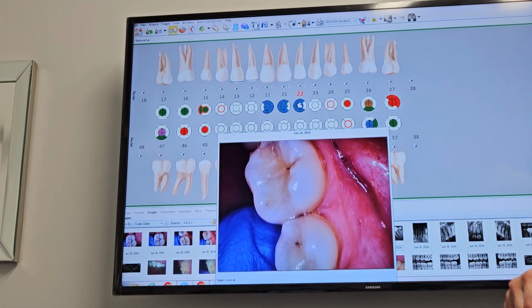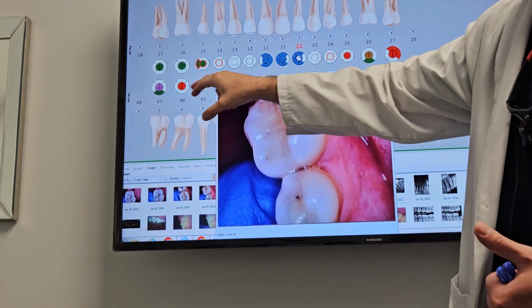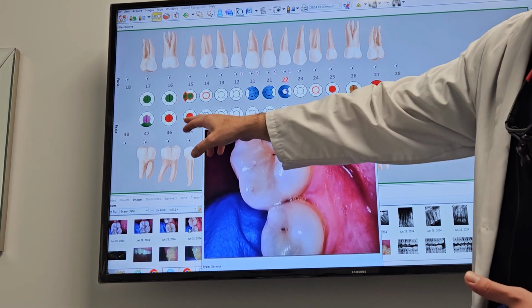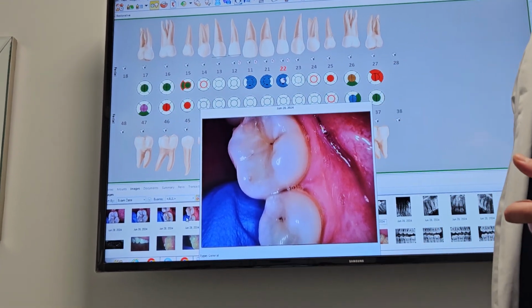So what's that color figure? It just means that you had a filling there that has a cavity. I technically see these have fillings. I think they were done at the other office. And what does the red mean? Red just means it's a new cavity, not a virgin, like these are old fillings. I got you.